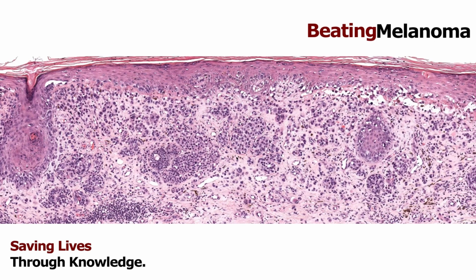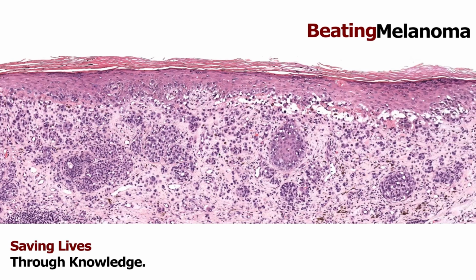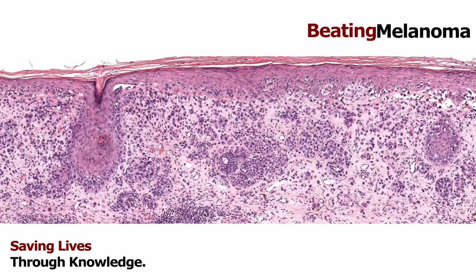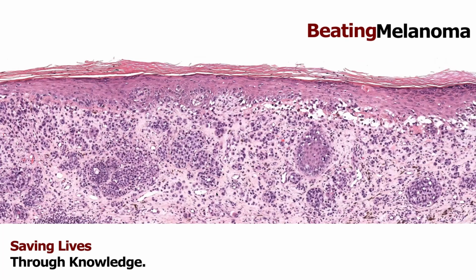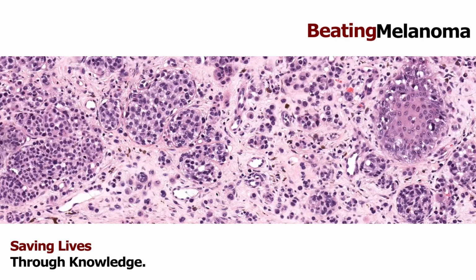Great question. In this particular example, where is the deepest melanoma cell and how do you measure it? Maybe you can walk us through that. Yeah, let's see here. So in this case, yes, that's what we do on every invasive melanoma. I measure a Breslow thickness.